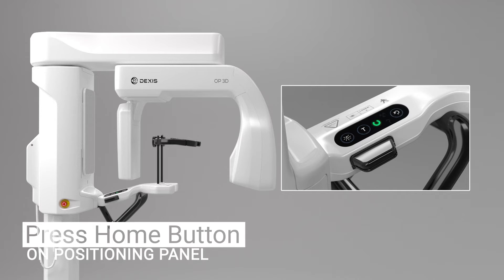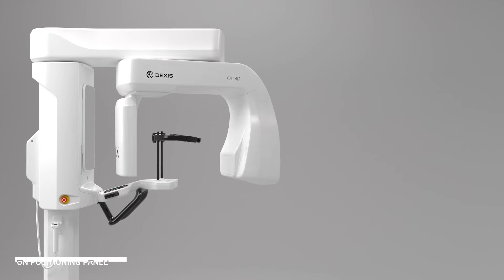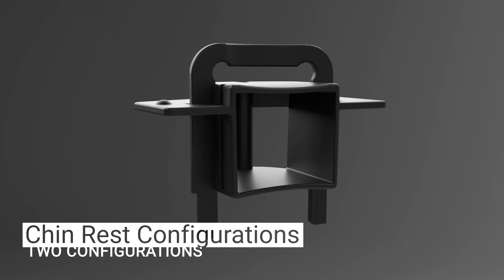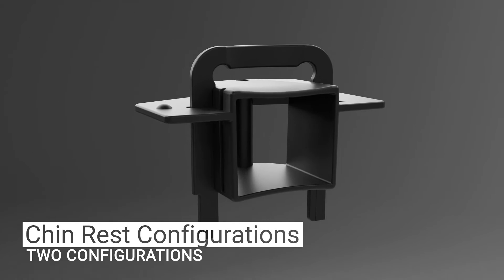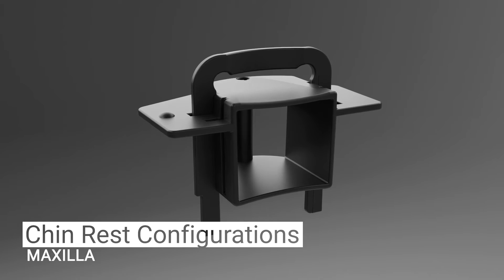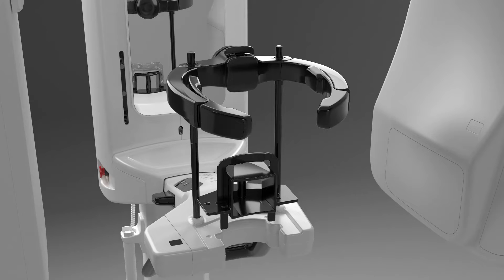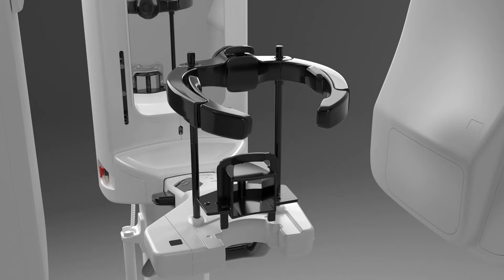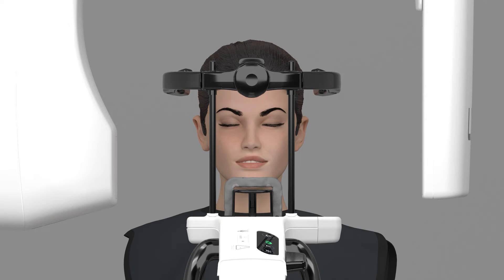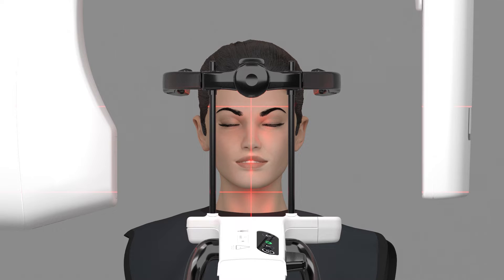Press the home button on the OP3D LX control panel and the unit will move to the home patient-in position. There are two chin rest configurations used when acquiring a 3D image — one for the maxilla and one for the mandible or dual jaws. With the chin rest pre-configured, place it onto the lower shelf of the device. It is also possible to acquire a 15x20 image without the use of the chin rest.